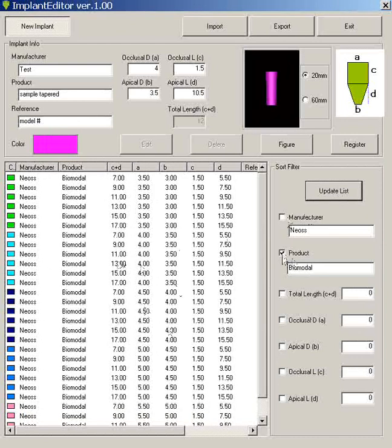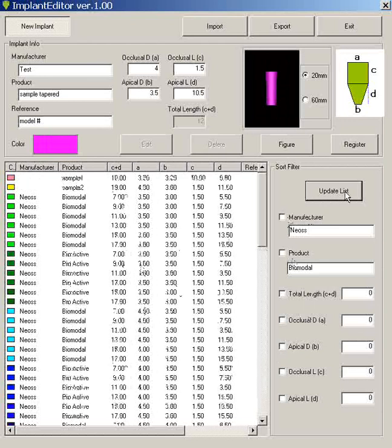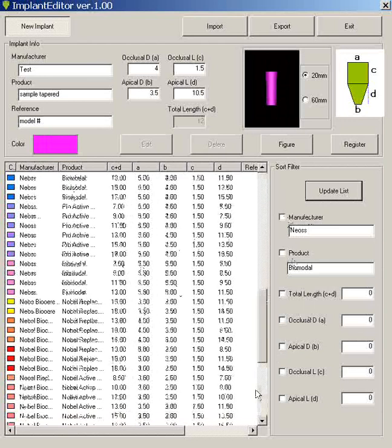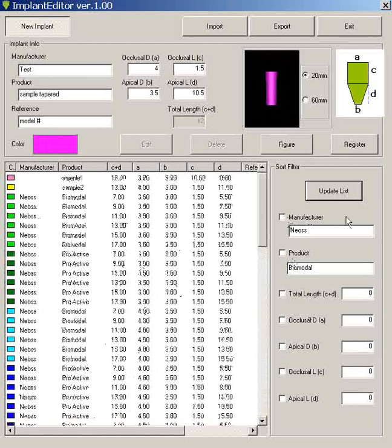To get all the list, uncheck the boxes and hit update list. And then you'll get the full library. Or you just search by the particular manufacturer that you wish to load only by itself.